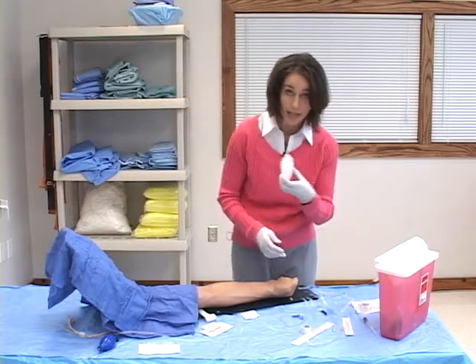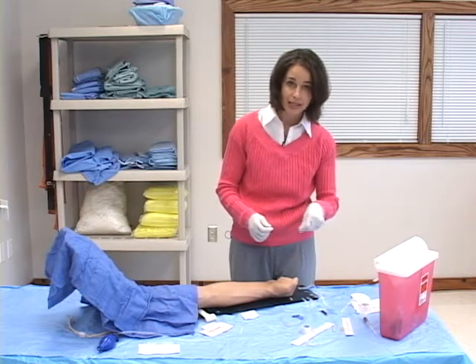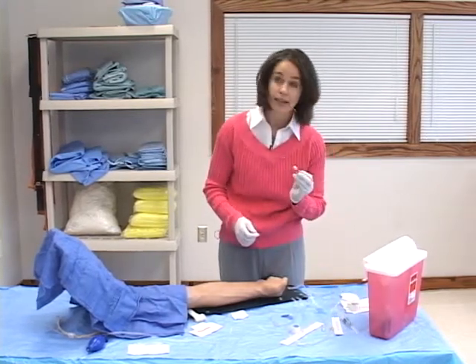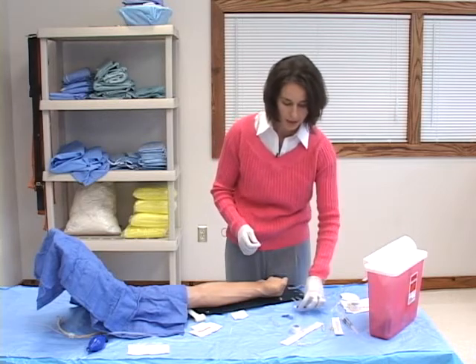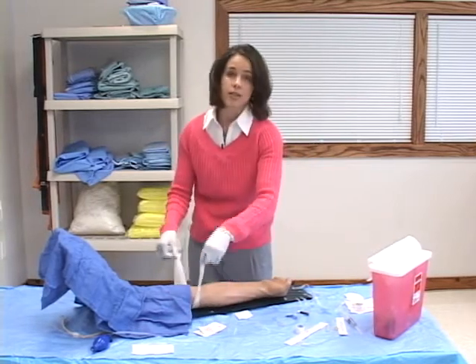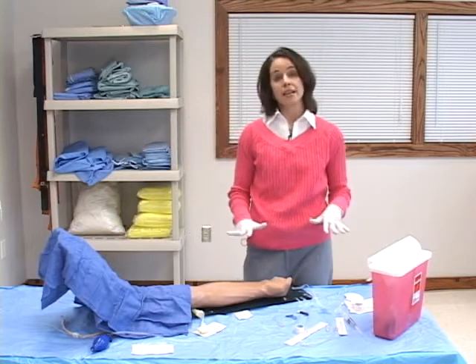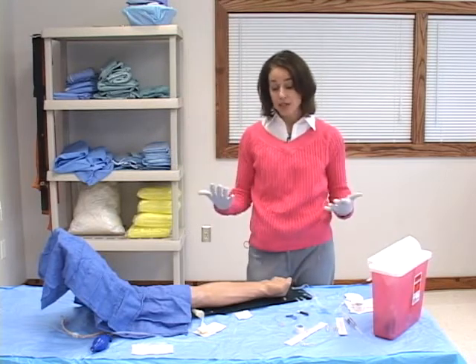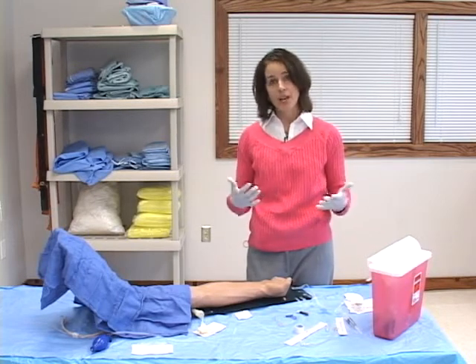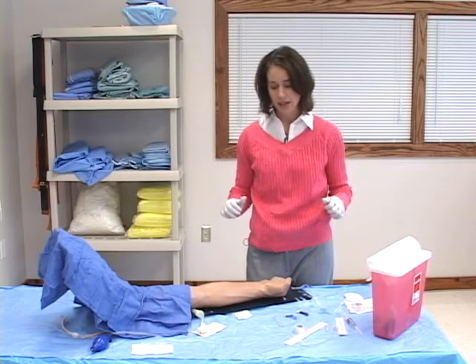I have my Tegaderm ready to secure the IV. I have my tape already torn into strips and ready to easily access just by pulling it. You already saw my saline flush. And then I have the iodine prep that I'm going to be cleansing the arm with prior to inserting the IV. And then I also am going to need a tourniquet, and you see it's already placed around this arm. So I'm going to have all my supplies ready before I start the procedure, because the last thing you want to do is actually get the stick in the right place and then have it come out because you don't have your tape ready or you don't have your tubing ready. So being prepared is an important part of starting an IV.